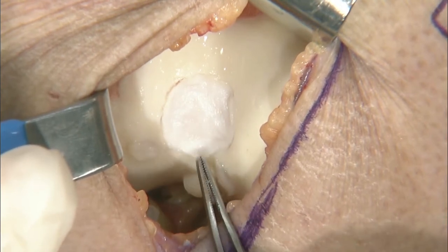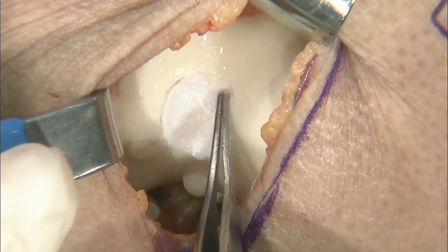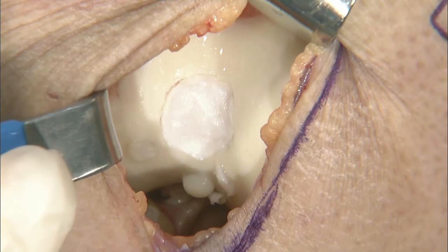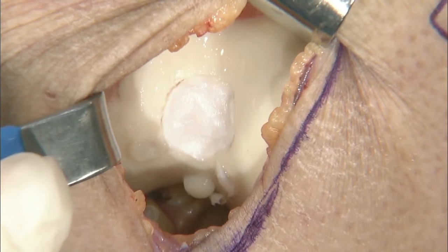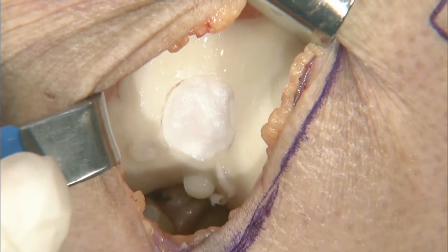So it's definitely worth your time to try and get in there and get as good of a size to that template if you can. And again, really undersized if anything. The cells are going to expand and they're going to move around. So I think undersizing is much more important because you're not going to love it if you have to try and cut it once it's in the defect. But I think overall this looks pretty good, and we would give this then 3 minutes at this point.